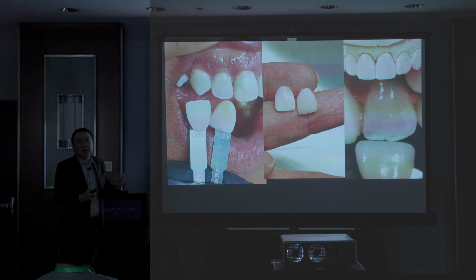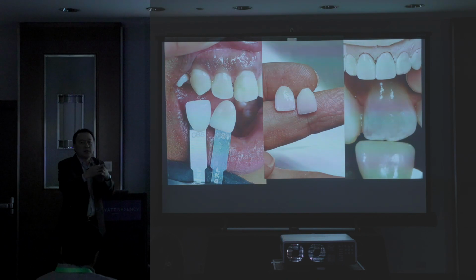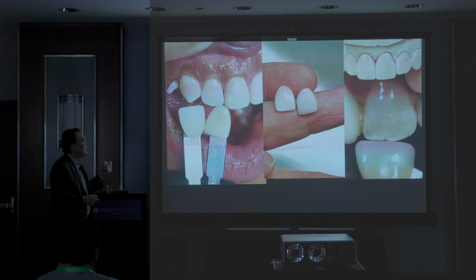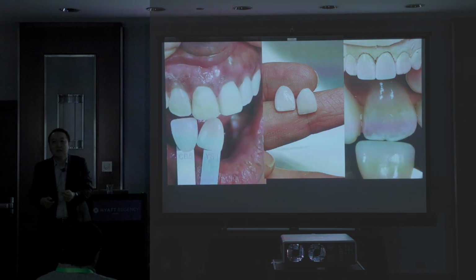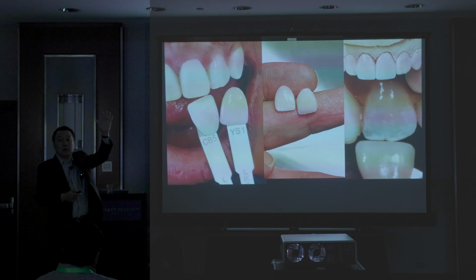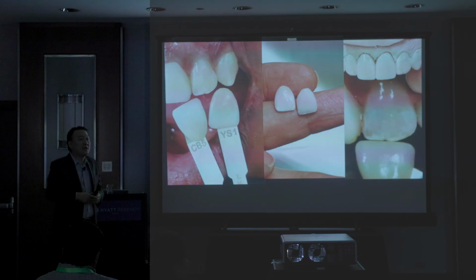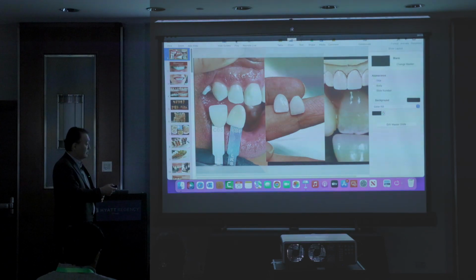Regarding the color, it's pretty simple. It's value and hue. Whenever I concentrate on a zirconia block, especially B&D, I concentrate on the value. What is the value? How much you block out the color. You know what I mean? So that's the starting point. Whenever I take the shade with a patient, sometimes you cannot find what you're looking for, right? Compared to Vita. We're all working with the Vita company, right? You guys know that 45 years you dedicated, you pay them, and nobody can solve the issue.